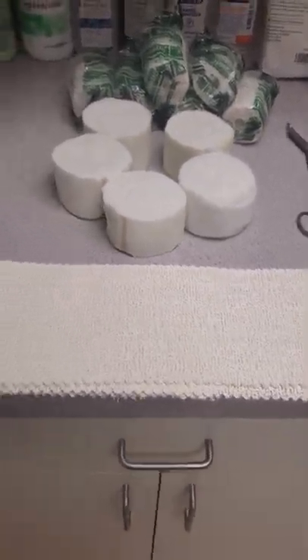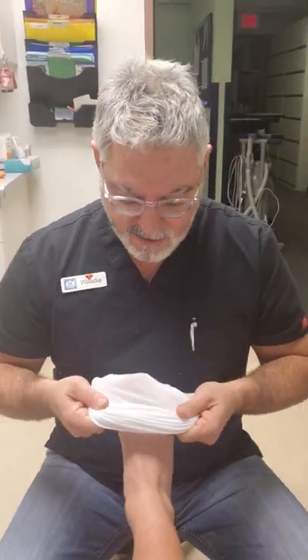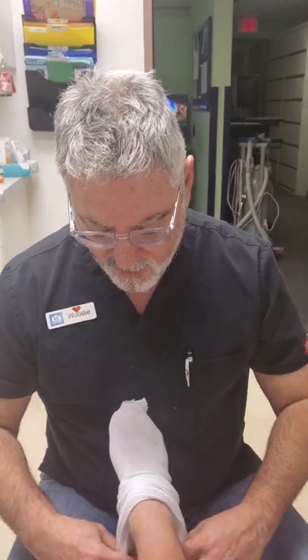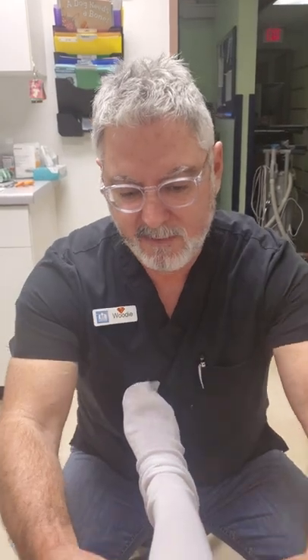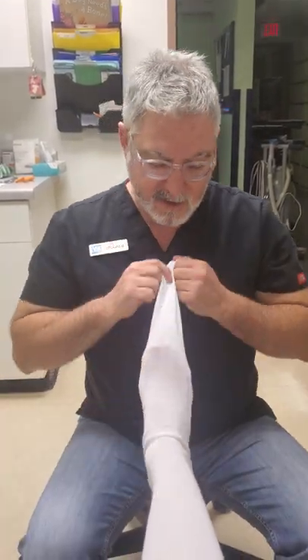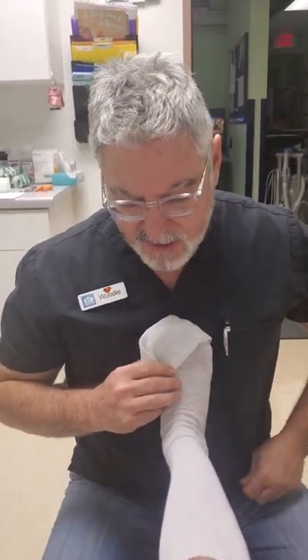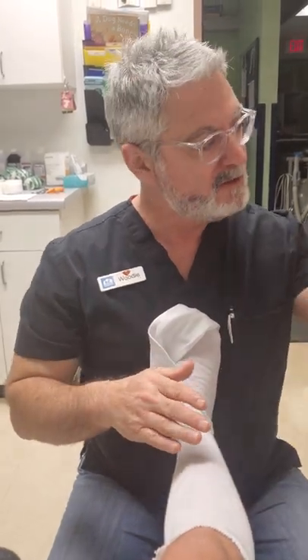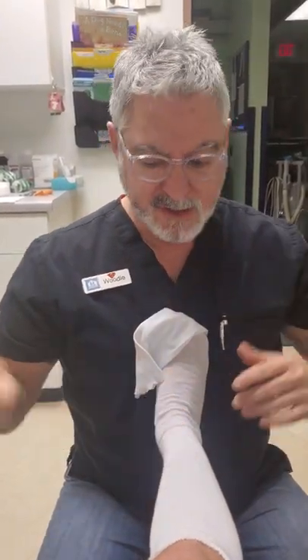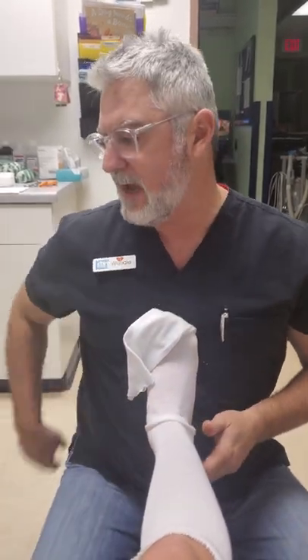So we're going to go ahead and jump right into it. A lot of this you guys have seen before. Typically there are two ways to create this short leg cast. You can do it with them laying on their belly and their foot, like you've seen in other videos, or you can use the cast stand, which I did a video about two or three videos back.